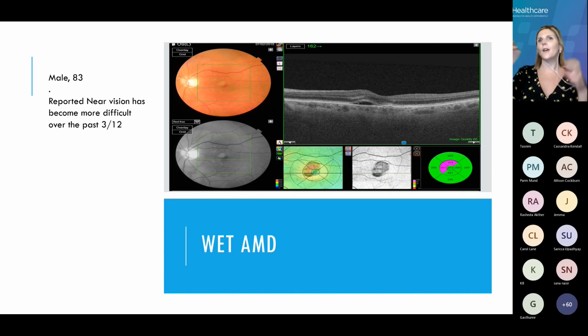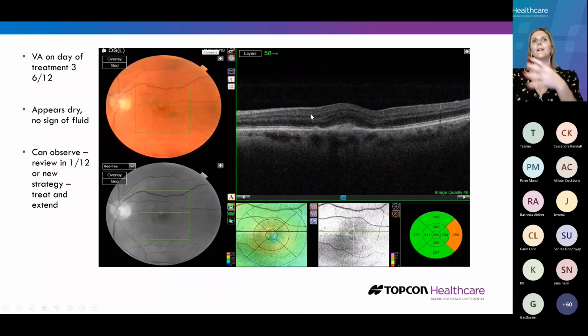You know, they'd have very large areas affected. That doesn't always happen. So being able to pull the information in for that patient is really important. Now, when you're looking at a patient and starting to pull the picture together, what's really important is to think about whether there were any age-related changes before and what's happening with this patient. So that's really important to how we then start to look after them and move forward.